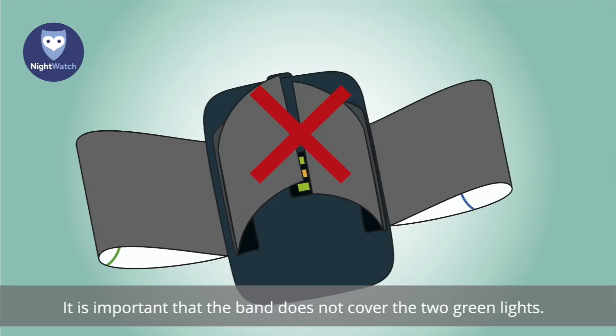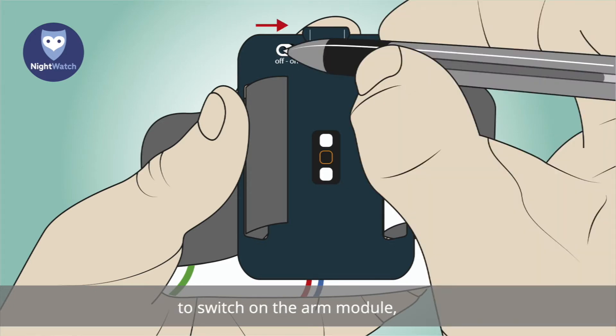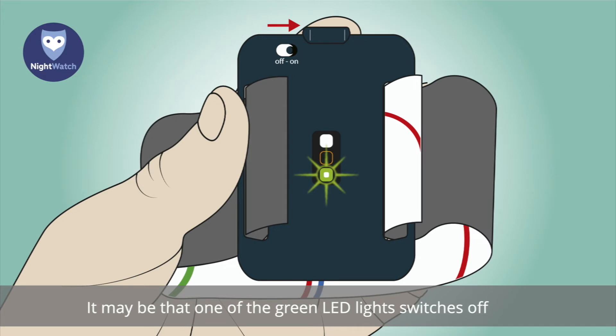It is important that the band does not cover the two green lights. Use a pointy object, such as a pen, to switch on the arm module using the switch on the dark-coloured side. Two green LED lights should now be visible — these lights are part of the heartbeat sensor. It may be that one of the green LED lights switches off after a while; this is normal.